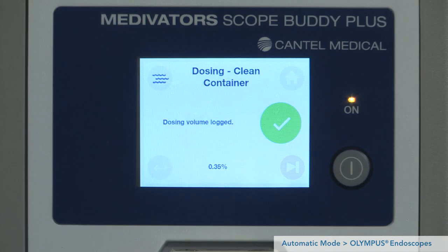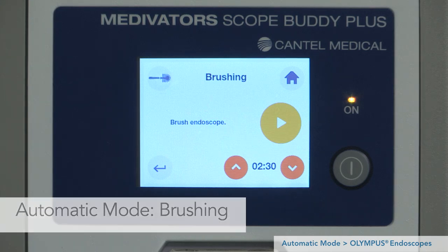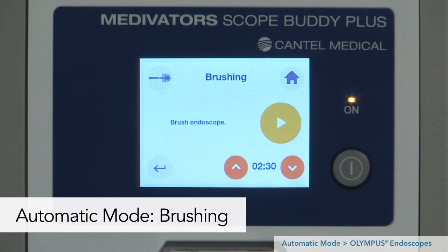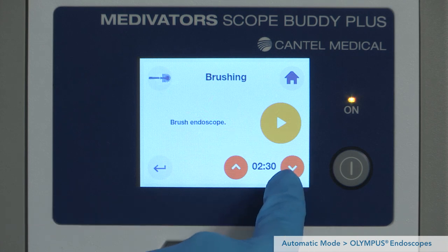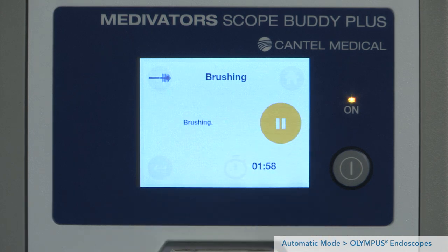Now let's move to the brushing step. The endoscope brushing step will be documented and a timer is provided. Using the up and down arrows, select the desired brushing time and press play to begin the timer. Brush the endoscope channels in accordance with the endoscope manufacturer's IFU. The time logged is displayed in the bottom right corner of the screen and recorded in the data log. The brushing step may be repeated if needed for extra time, or you may move to the next step.